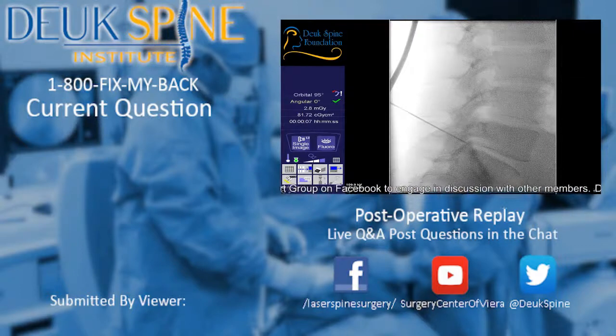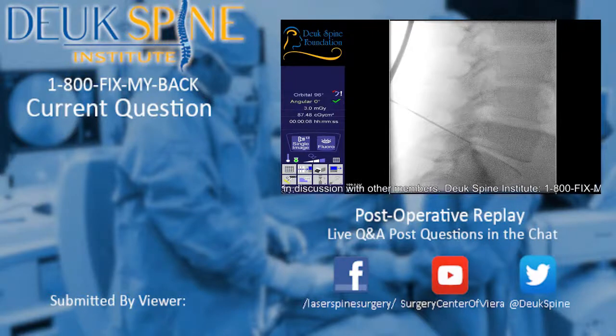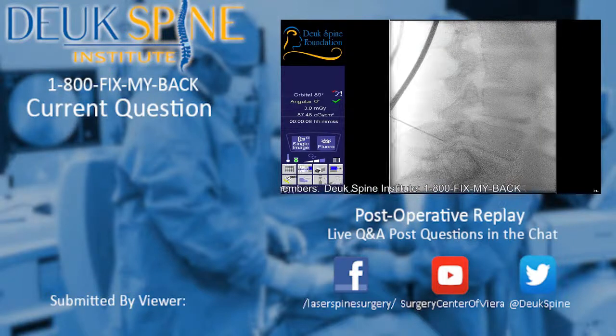And there was a lot of scar tissue as a result of multiple herniations, especially at L5-S1, that just socked in that disc herniation and held it up against the nerve root in the epidural space. I tried to get underneath it and pull it down as much as I could. I used a lot of different tools and techniques. You saw me use the Grabzilla. We used the standard pituitary. We used the laser. I went for a lateral approach, really far lateral entry point, and aimed more medial.